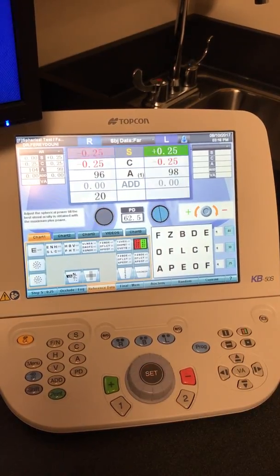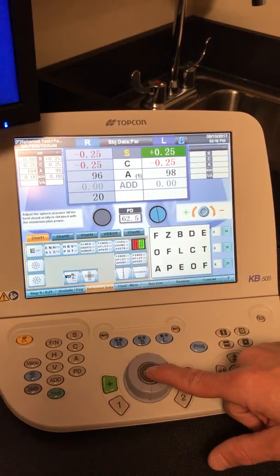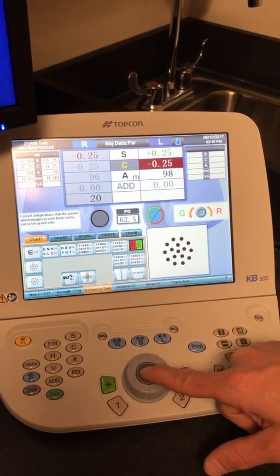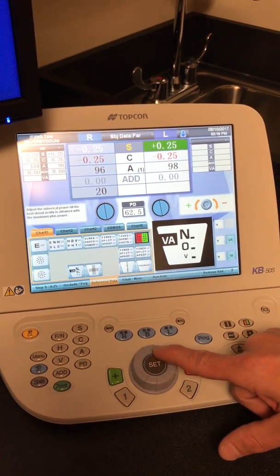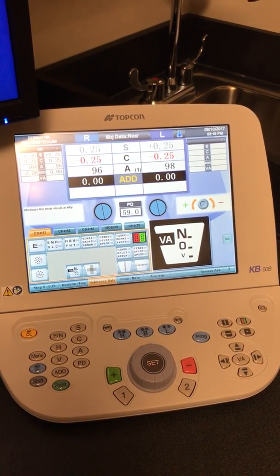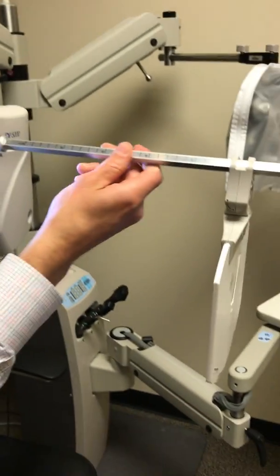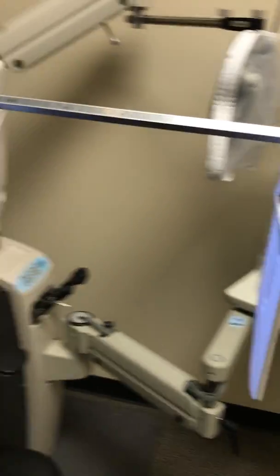You're going to hit set again, and now we're going to move over to the left side, and the process is exactly the same. I'm just going to go through it for time-saving purposes here. Once we finish that one, we're going to move over to the near test. Now we're using the near test, so you have to actually go over to the phoropter and pull down the reading card. The light is already coming out of the phoropter, and the patient will look in there to read the near chart.